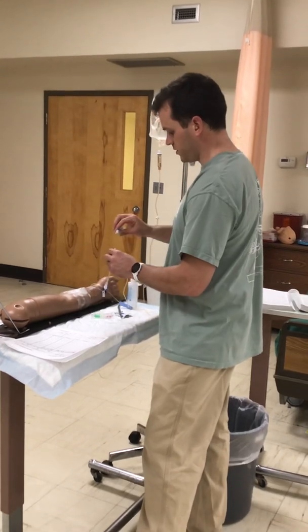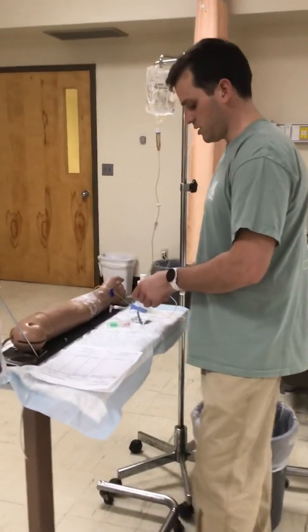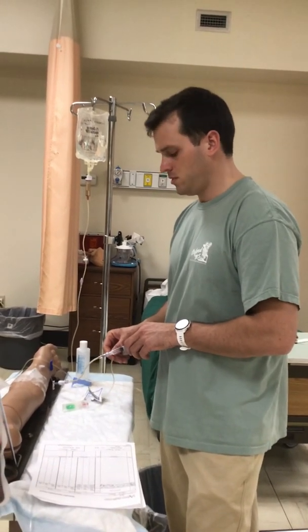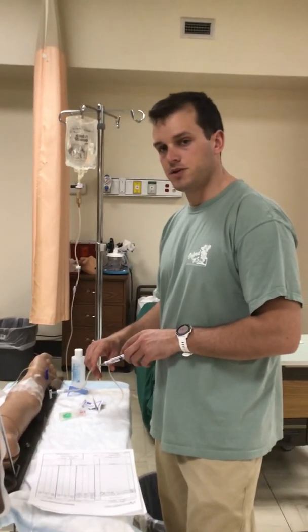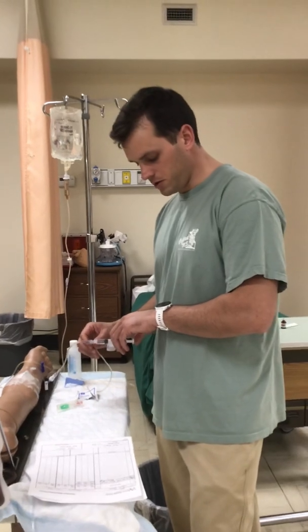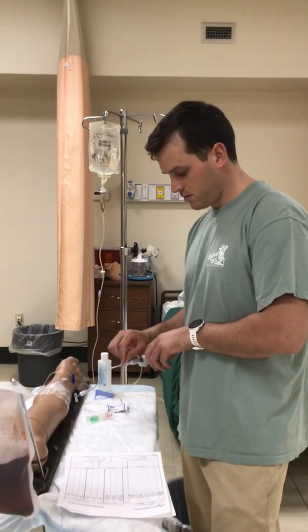Take off my filtered needle, attach it to my hub, and this is what we call the pinch release method. So basically what I'm going to be doing to flush the line is pinch the primary, administer, release, pinch, release, administer, pinch, release, administer. I'm going to be doing this over 2 minutes. 3 milliliters over 2 minutes, so that is 1.5 milliliters per minute.